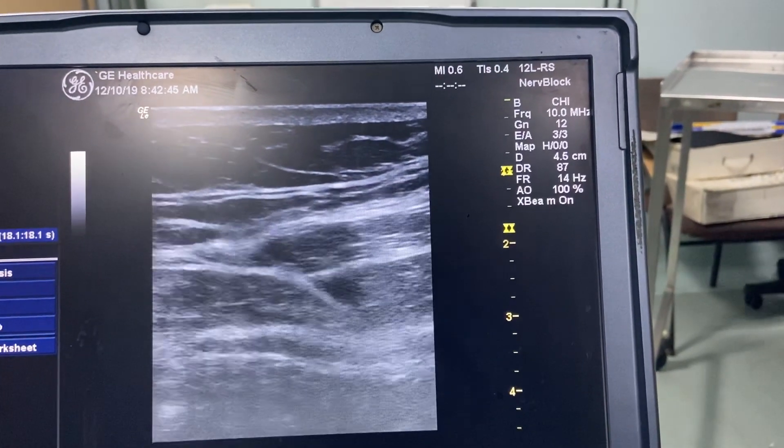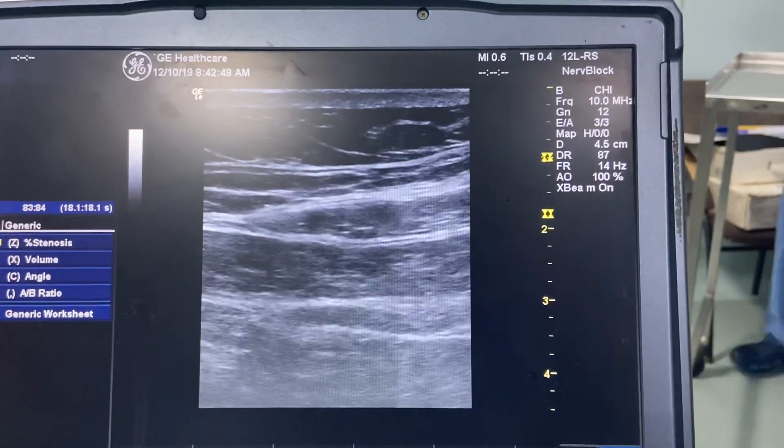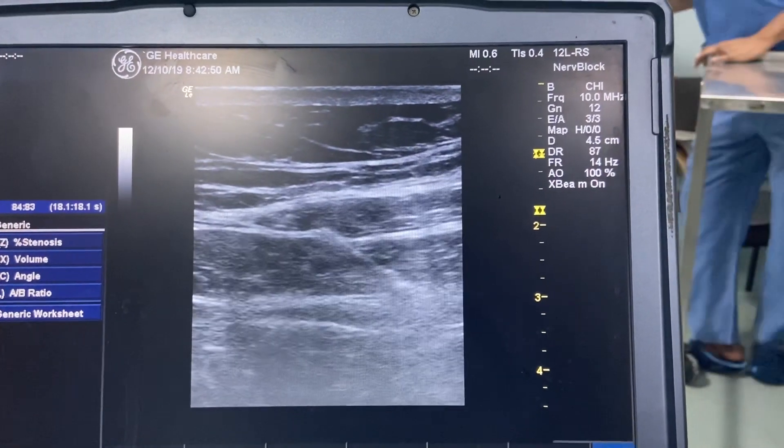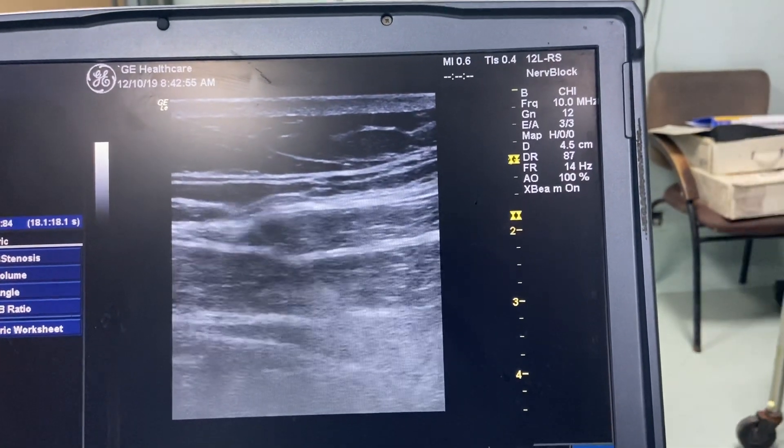We will go through the external oblique fascia and then reach the internal oblique fascia. Here you can see he has reached the internal oblique fascia. He has injected a few ml of the drug. There is some air and some re-adjustment is needed.